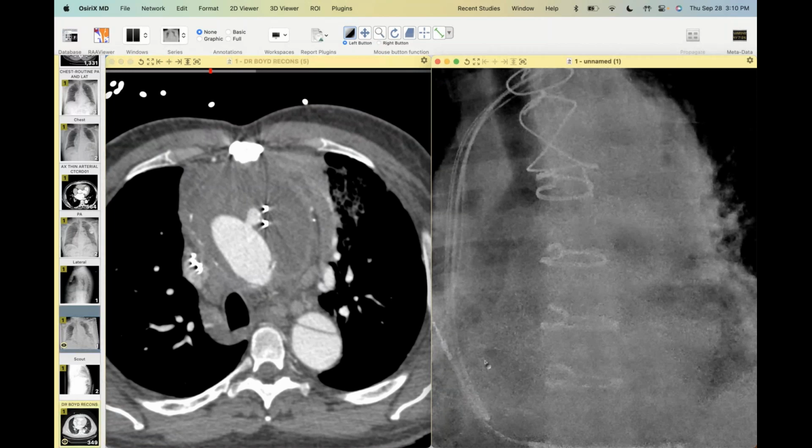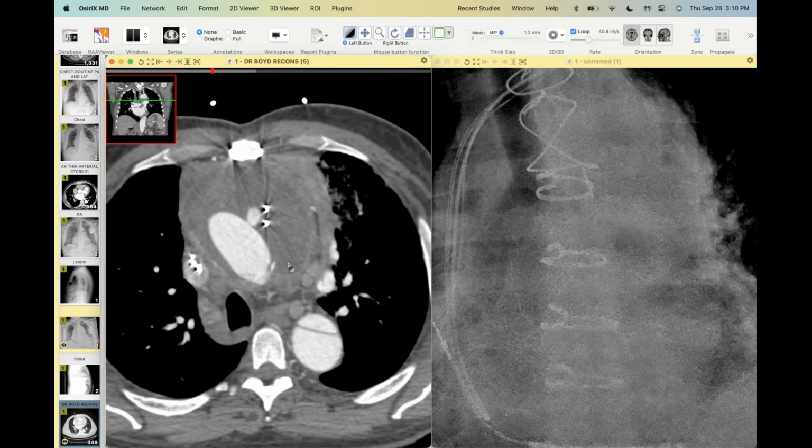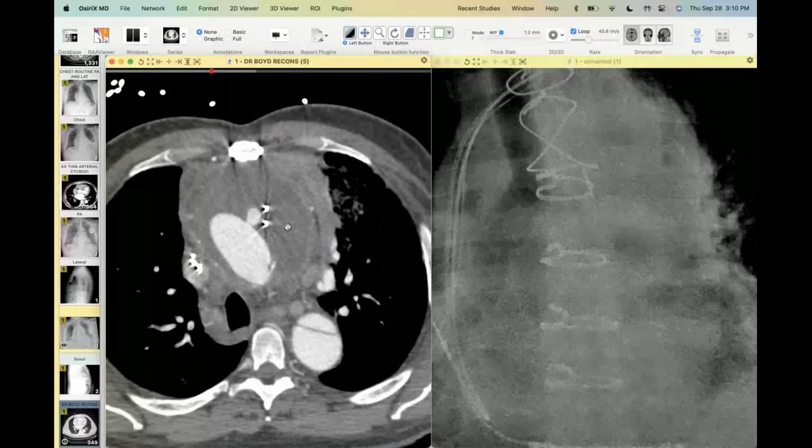I wouldn't even have seen the marker on that second one because it just looks like a piece of the wire. Yeah, I know, right? And in pre-CT days, it was stuff like this or a change in orientation of a prosthetic valve that clued you into some sort of surgical failure. Obviously now we have the benefit of CT, so it's more just an academic exercise, but it could save somebody in the future when they're looking at one of these prospectively. That is the only case I've seen where the marker was of any use.